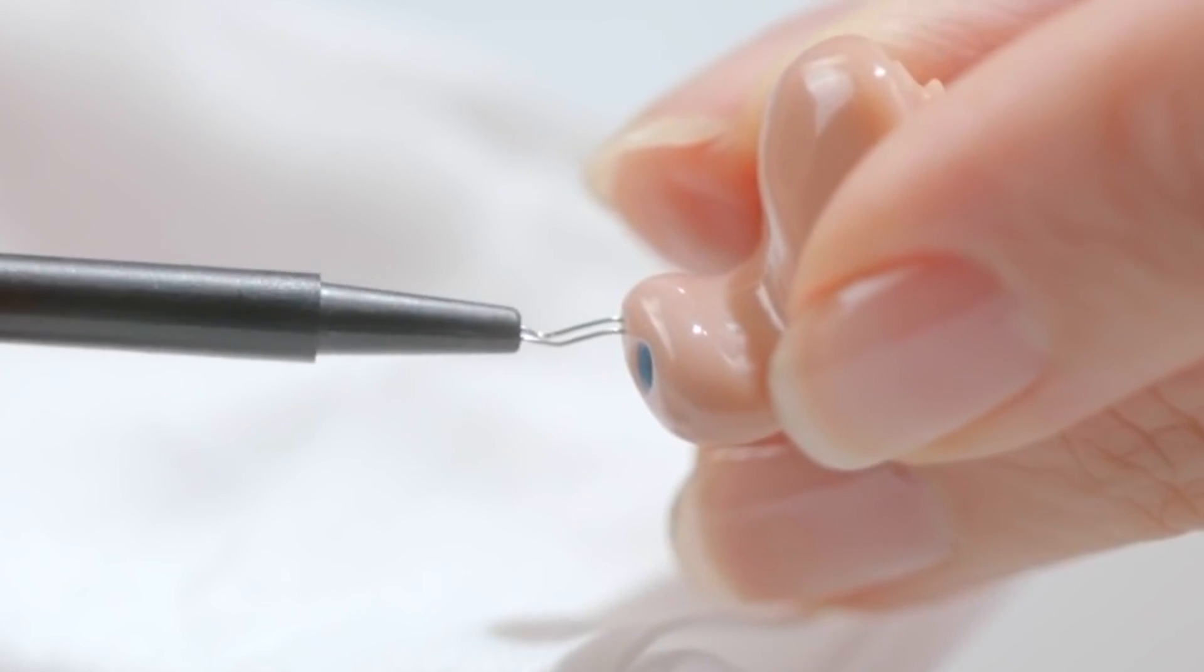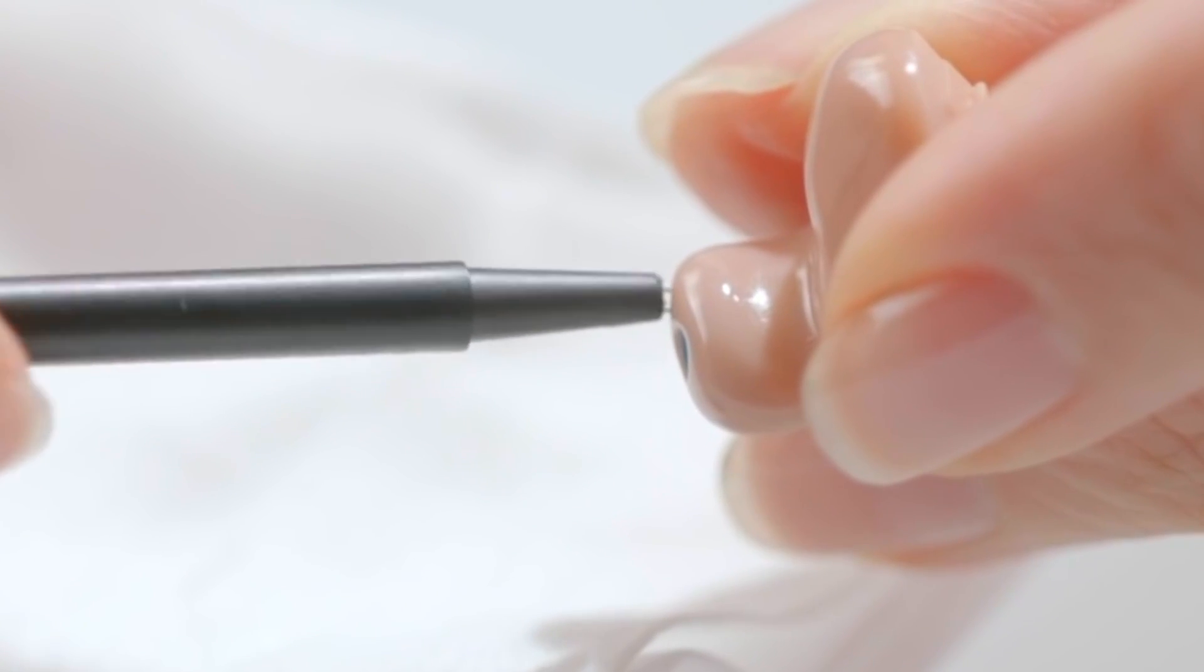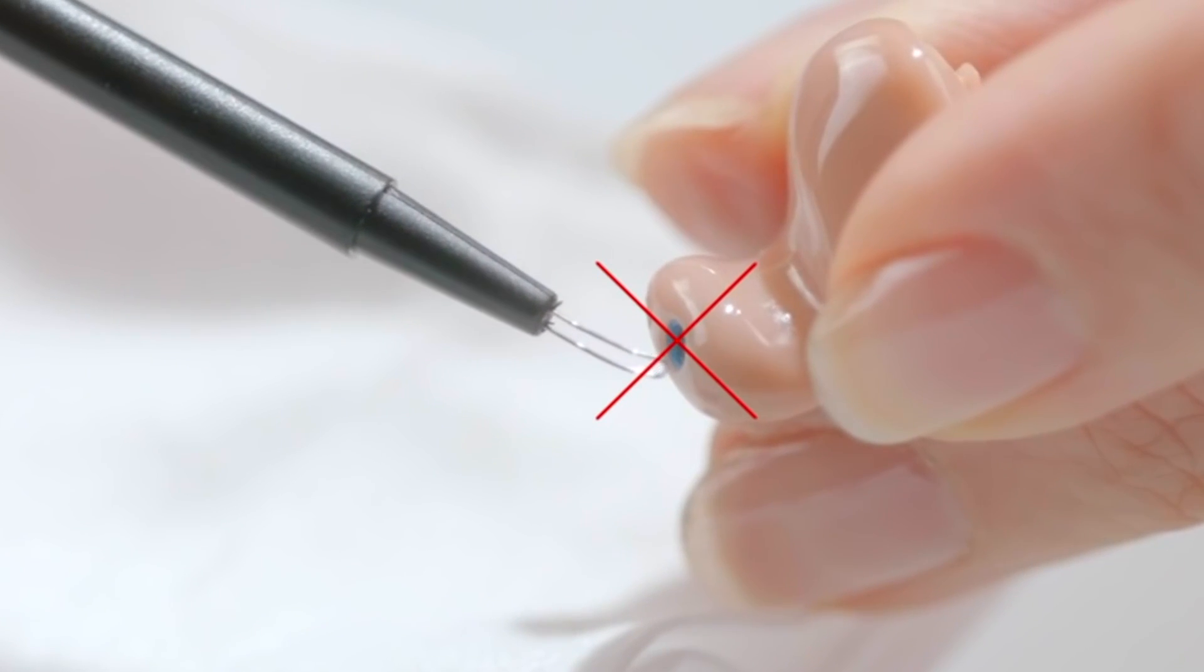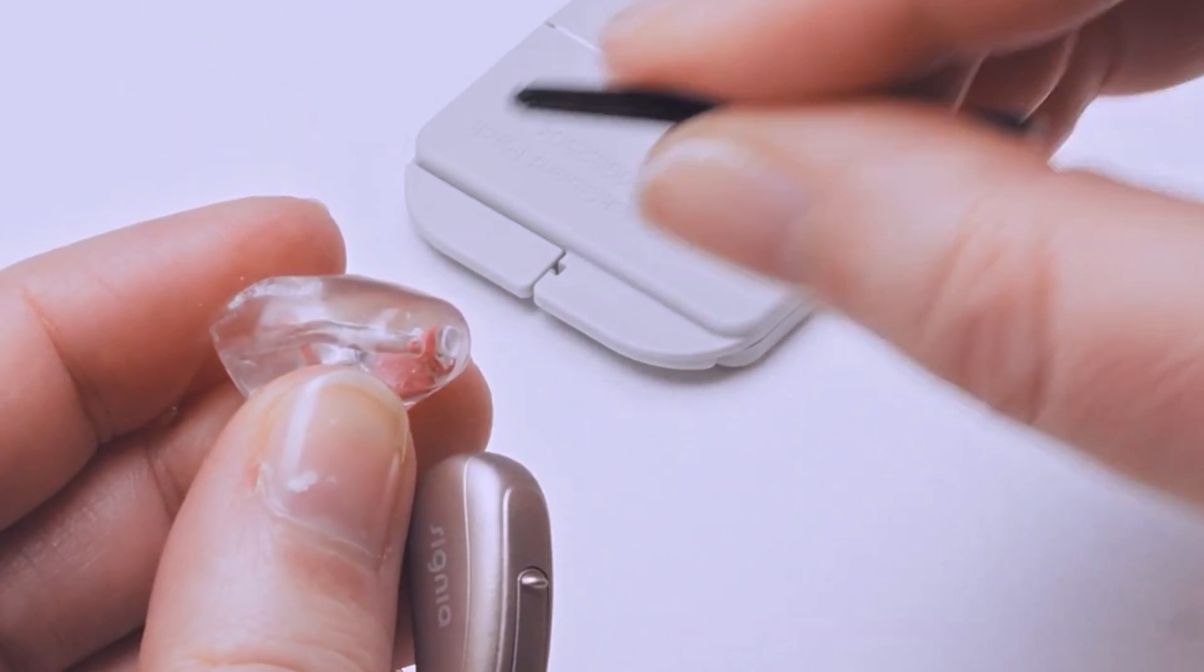For the vent opening, a tiny curette can also be used to remove any earwax debris located deeper into the vent opening. But do not use a curette to clean the wax guard. Rather, replace the wax guard with a new one.